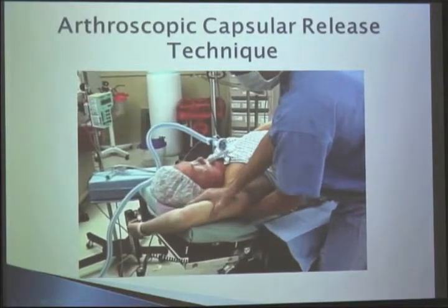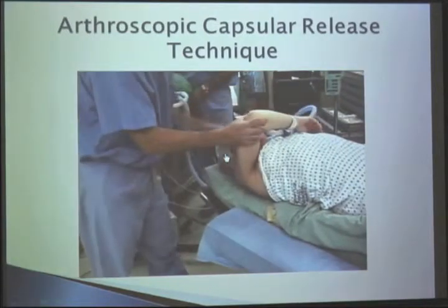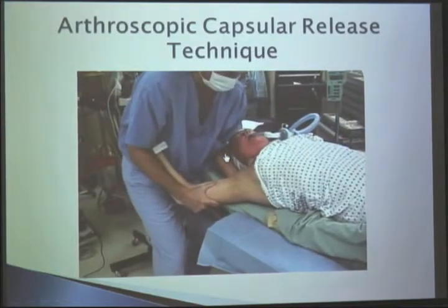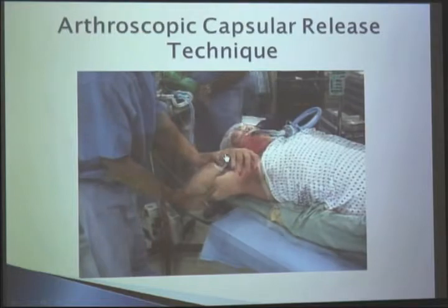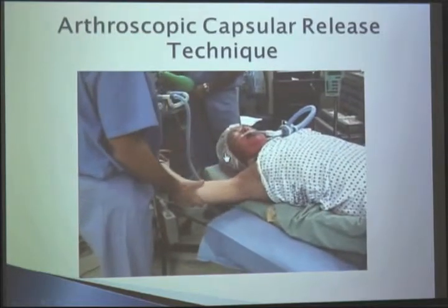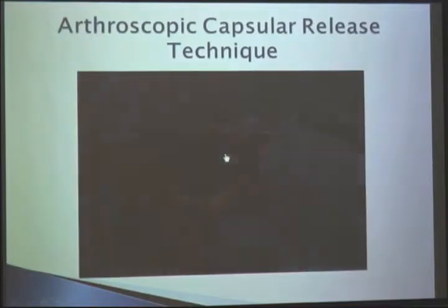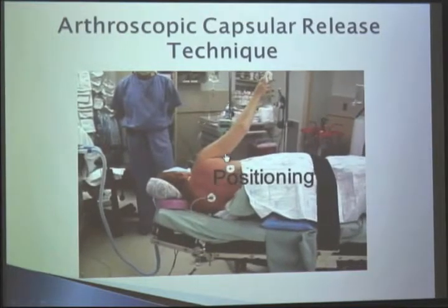In rare occasions, we get back enough motion, it's easy to do so that you don't proceed with an arthroscopic release. That's extremely uncommon. Most patients, if you've selected the right ones, you're not going to easily manipulate them alone. They're still going to have some residual restriction when you're done manipulating them.